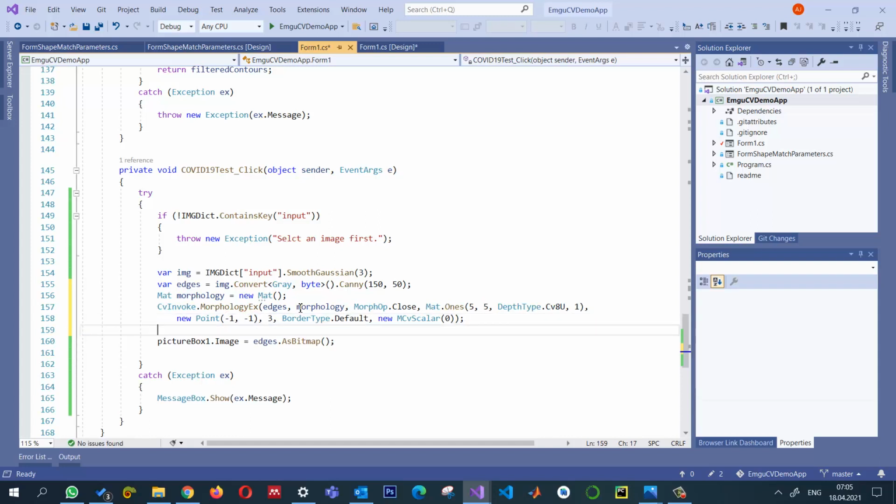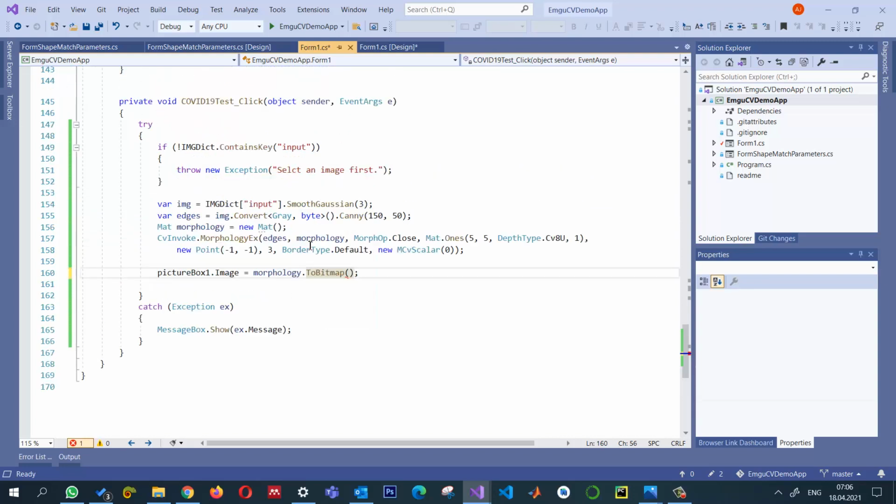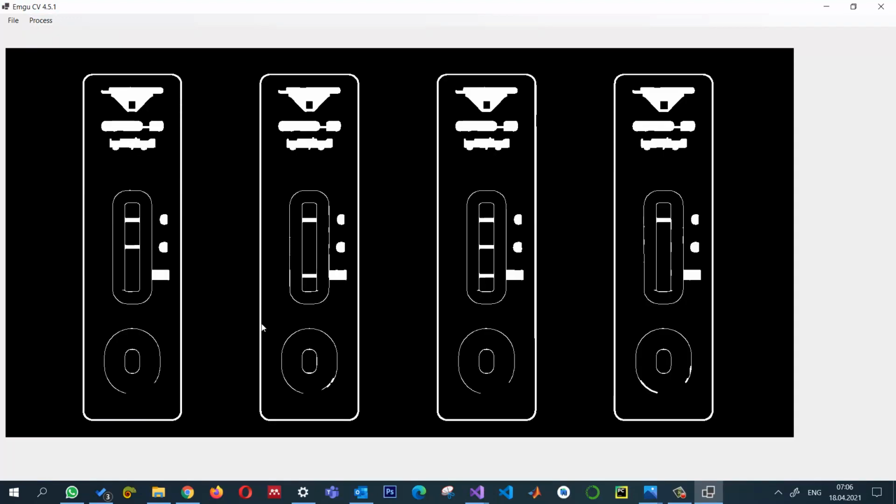Okay, so once we do the morphology, let's see the results. Actually, this is also important. If there is any problem, I don't need to do it again. Morphology, we have to use to bitmap. Okay, let us run it, and again when we set it, okay, looks good.